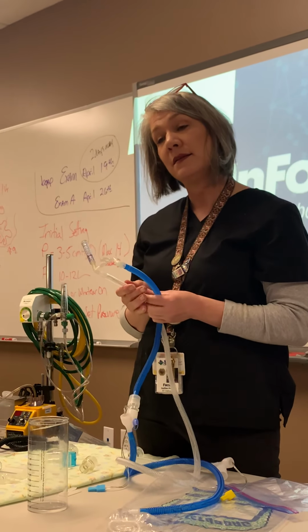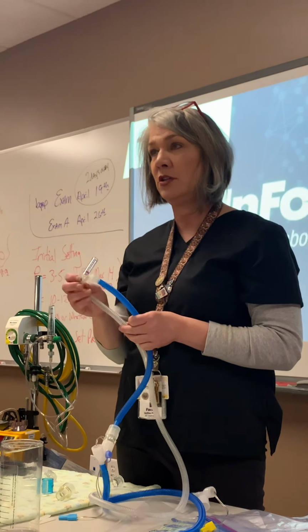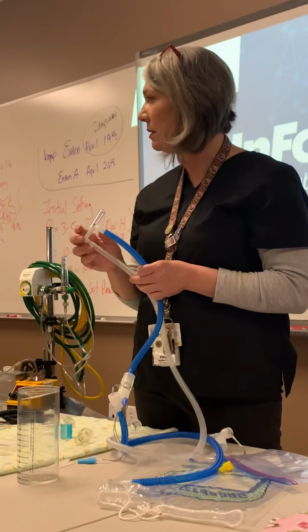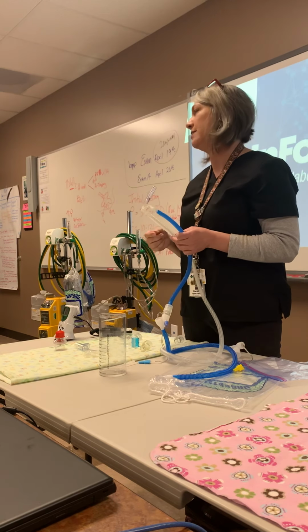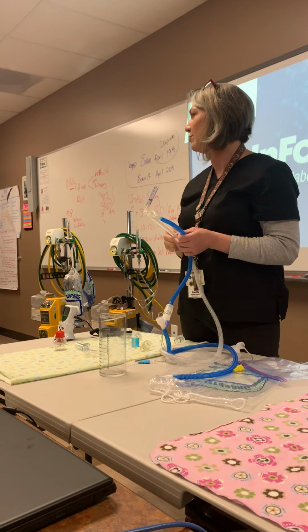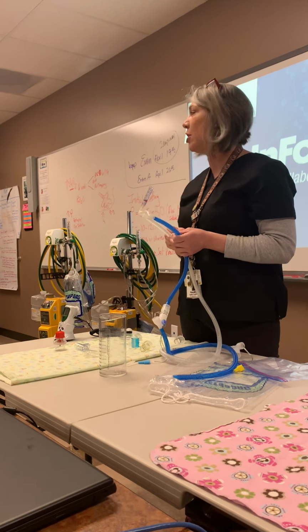Next, Cannulate. I showed you Cannulate last week. I did learn UC Davis is no longer using the Cannulate. They're using, what did they call it? It's like Tegaderm, but it's clear, and it comes in a sheet. They're doing crafts to make a little nasal coverage, like the ones they use for BiPAP. It's got a sticky side. So that's all they're using now.